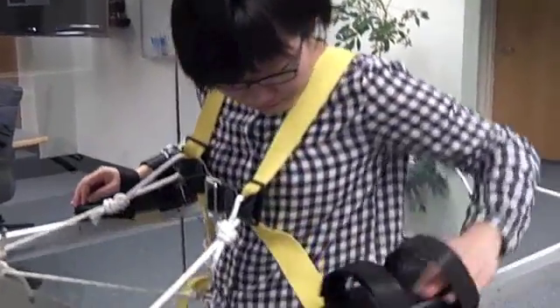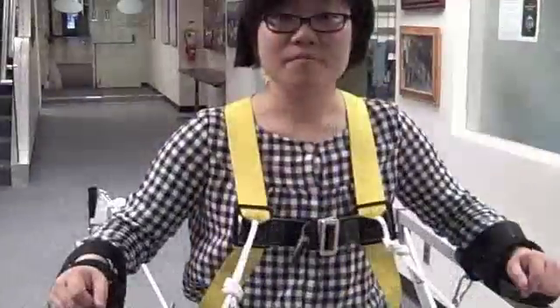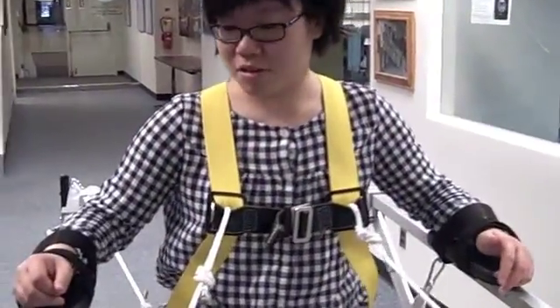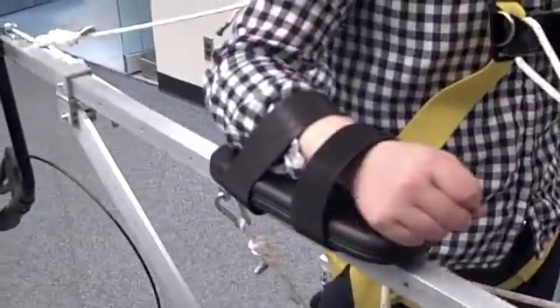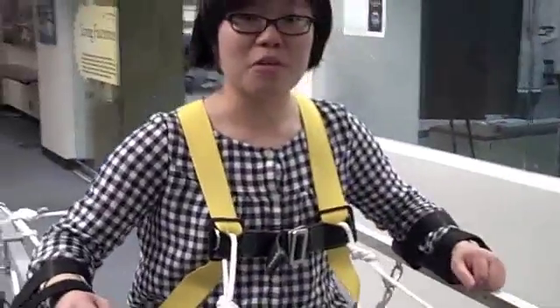There are also leg straps attached to the side and the bottom side of the frame to prevent my legs from crossing when I walk. The gait trainer also includes armrests that can keep my arms in place while I'm walking.